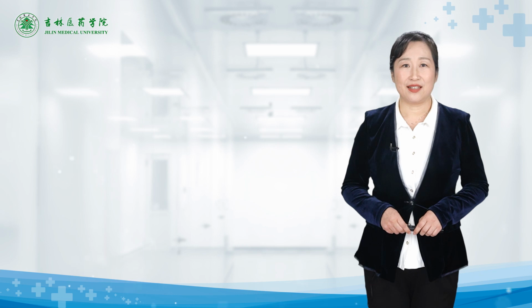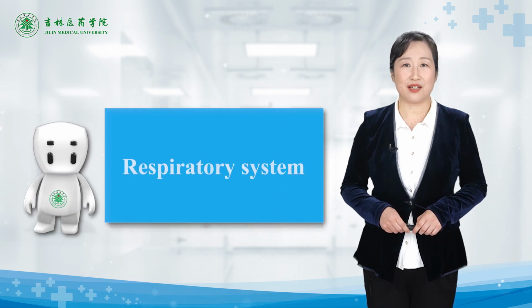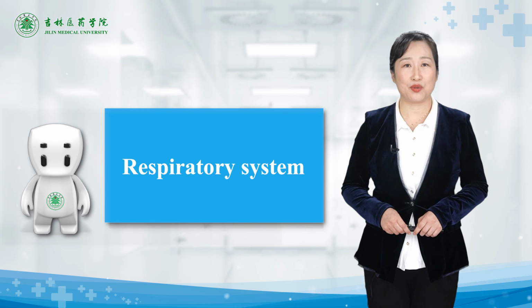Hello everyone. In this lab, we'll observe the histology slide of respiratory system.